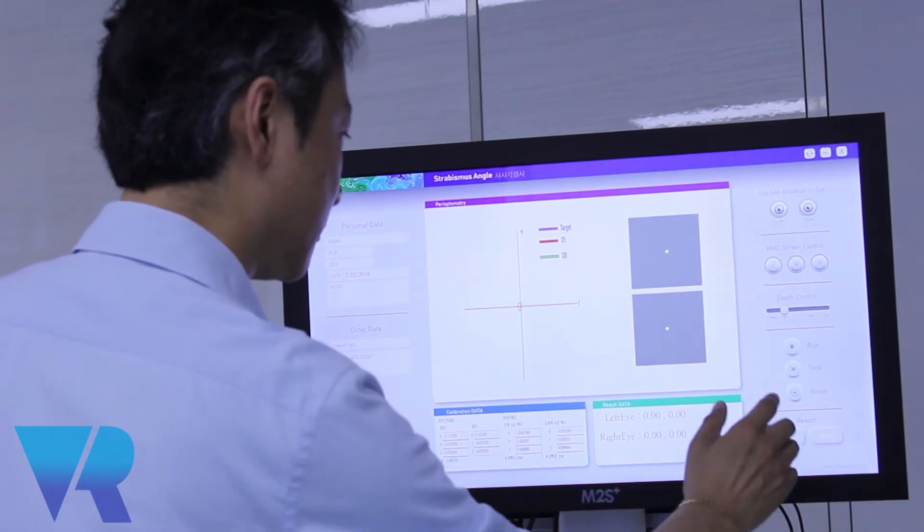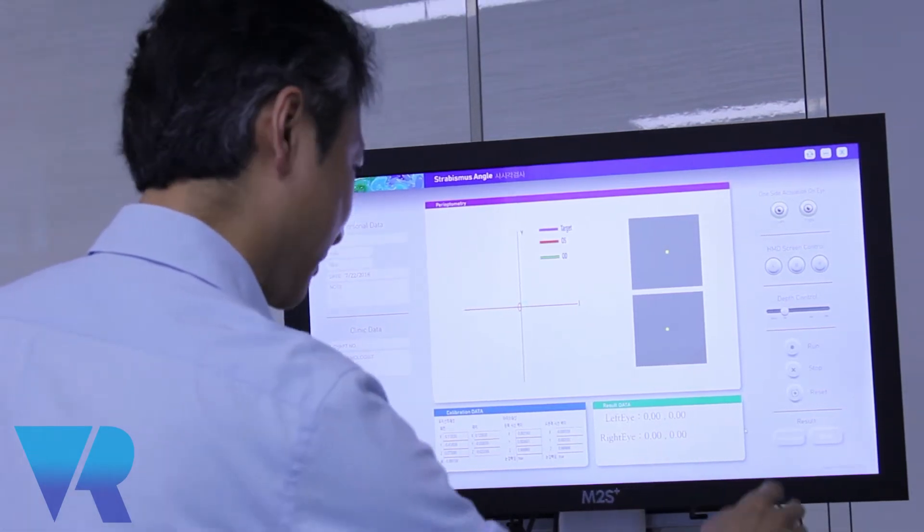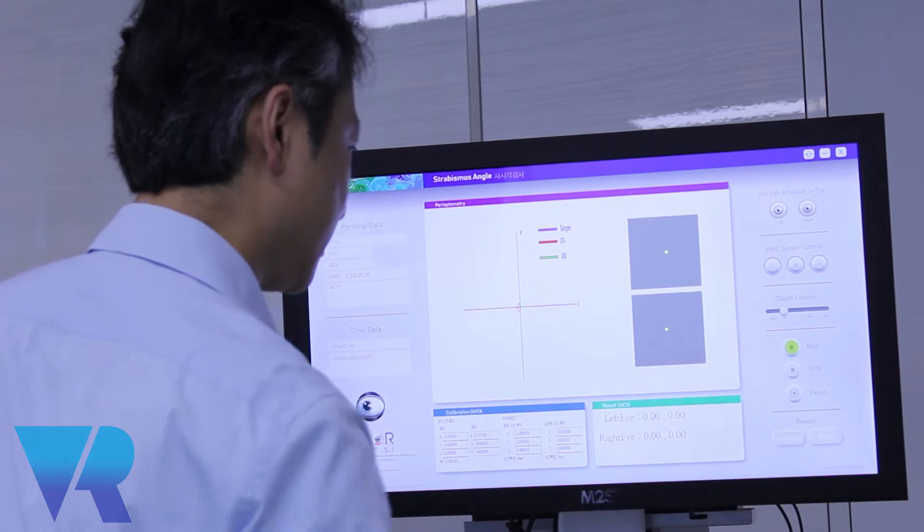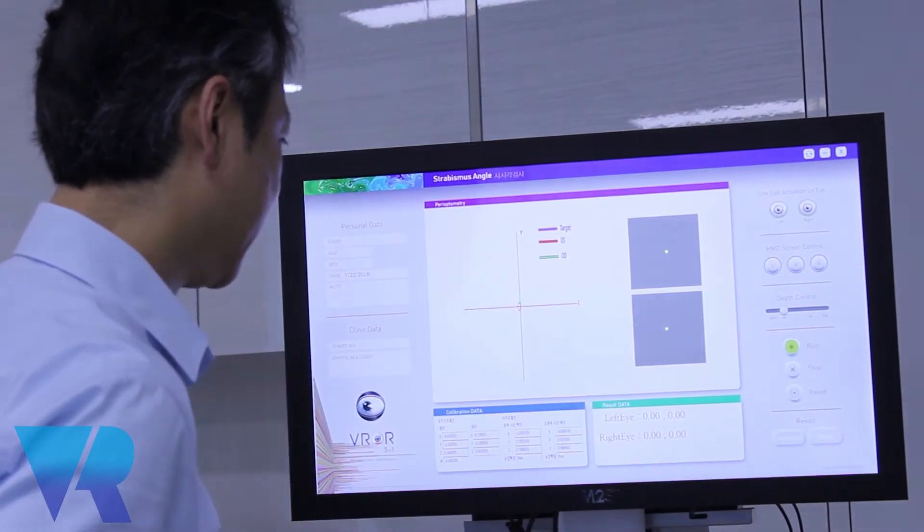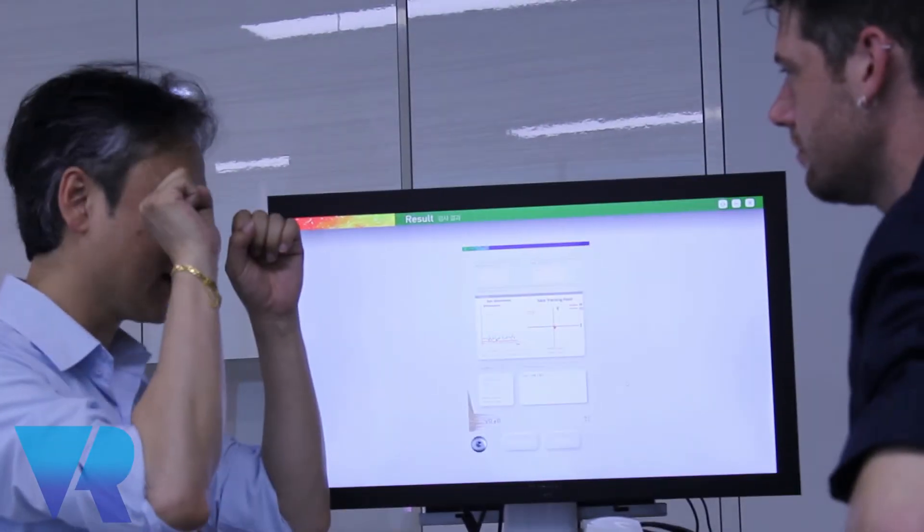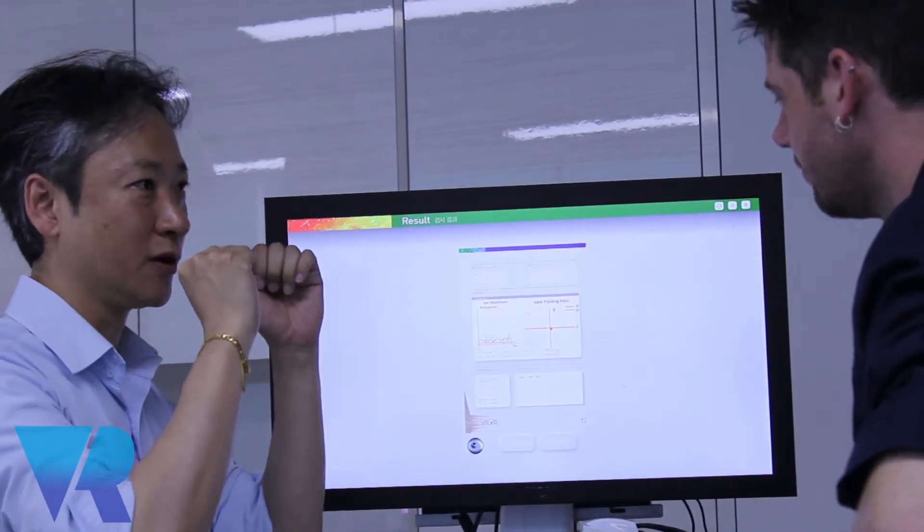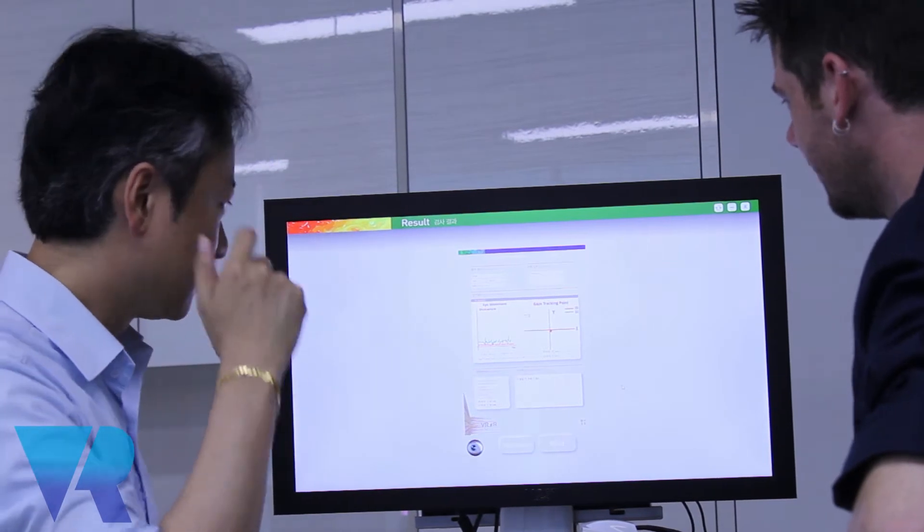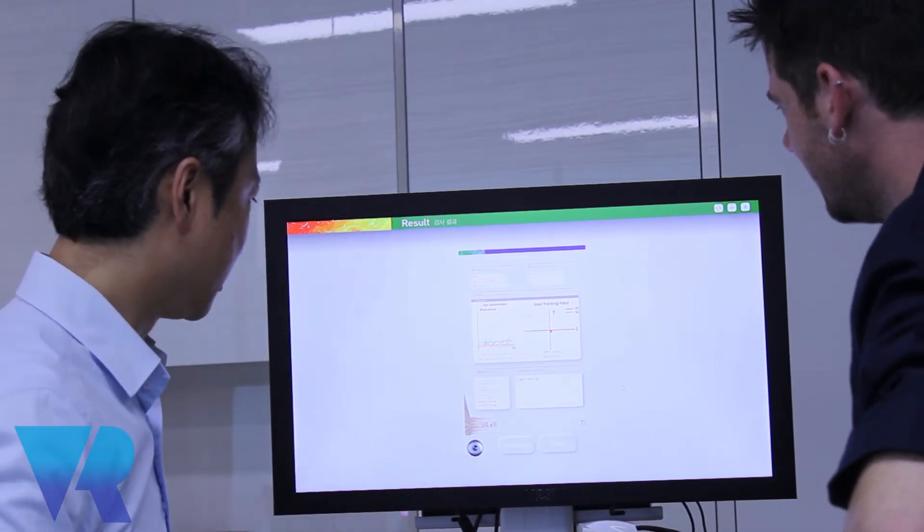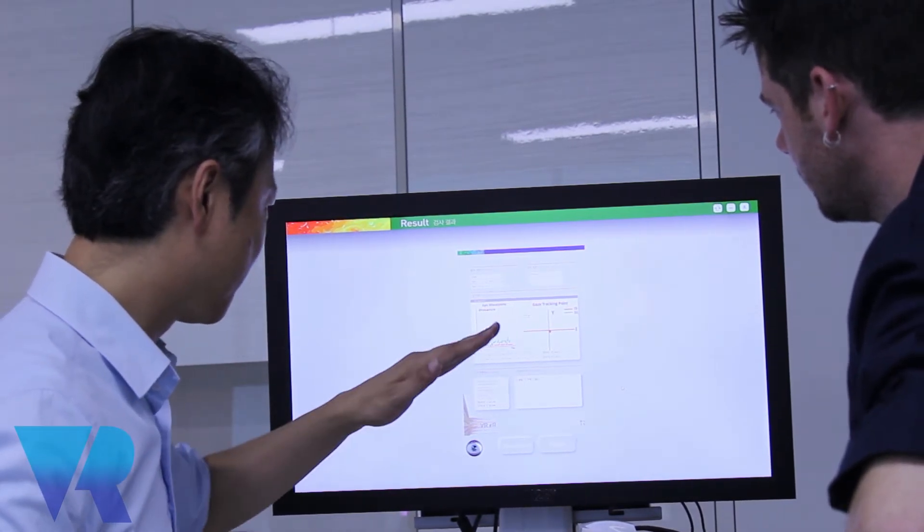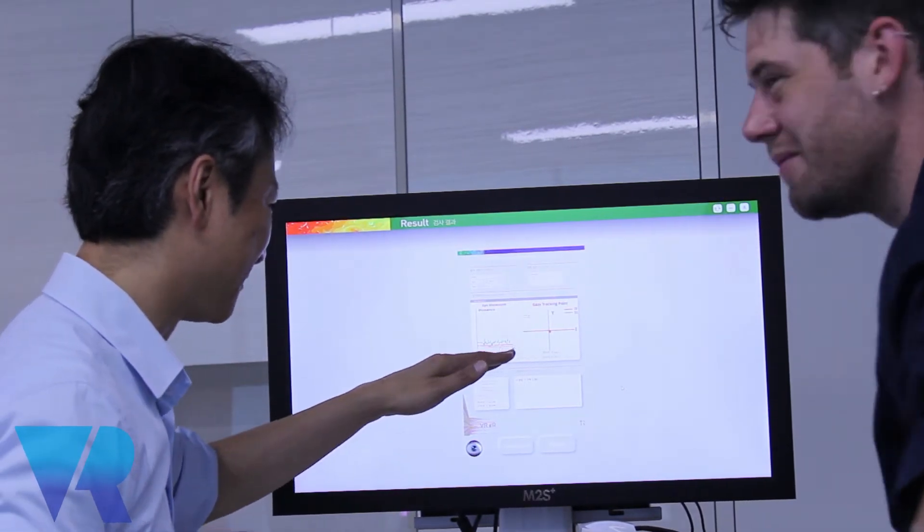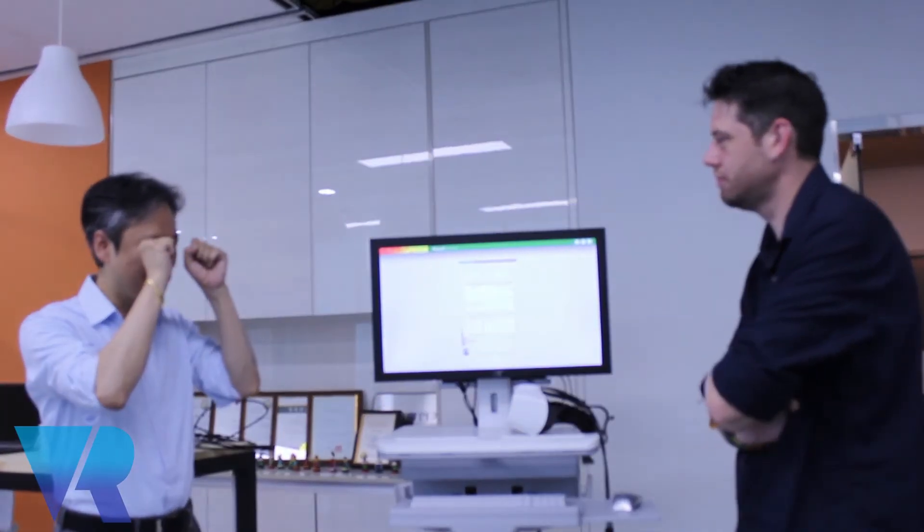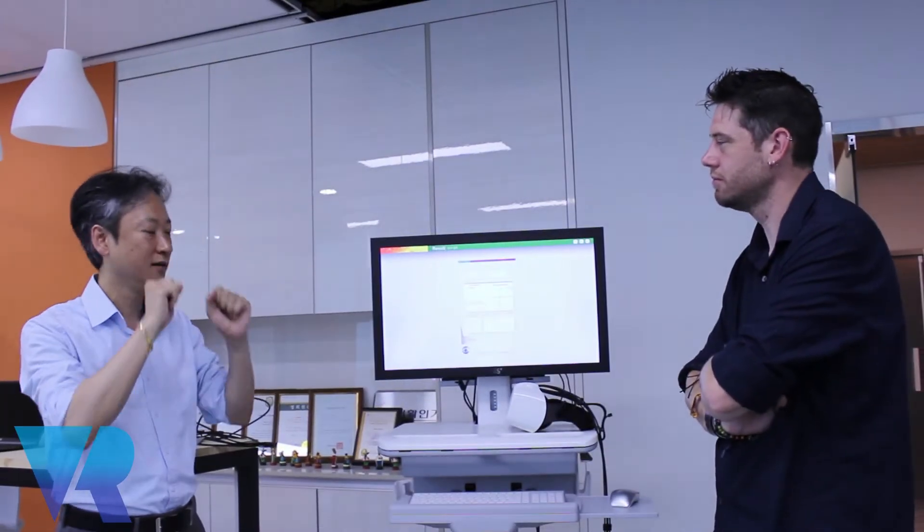I'm just staring at the dots. Exactly. It begins. You don't have any angle problem with your eyes. That's good, which is really good. I haven't seen this perfect result before. Most of the people are a little bit off.